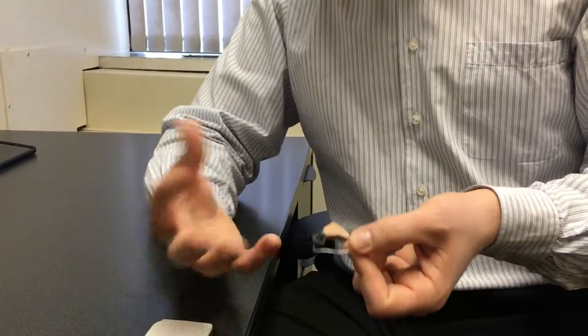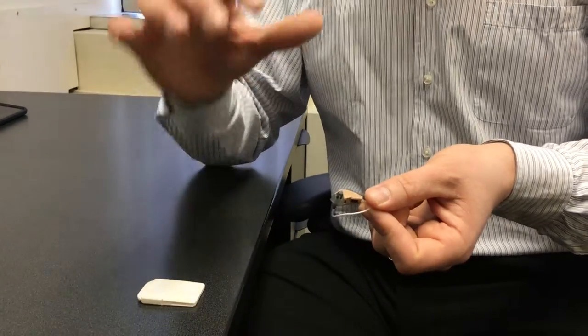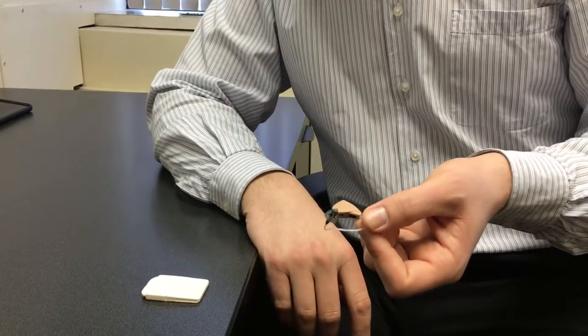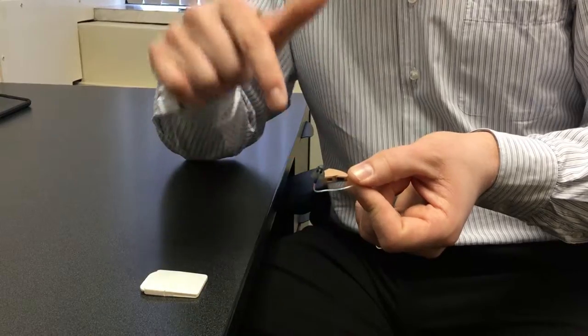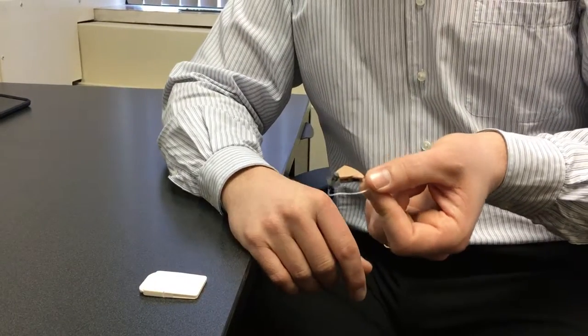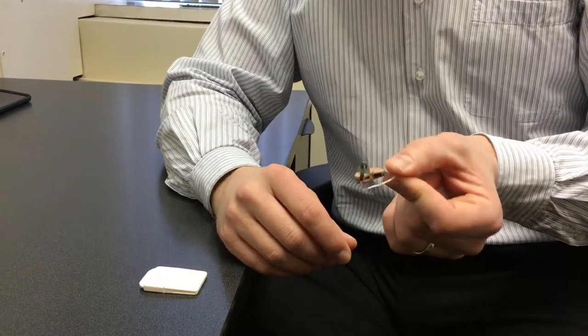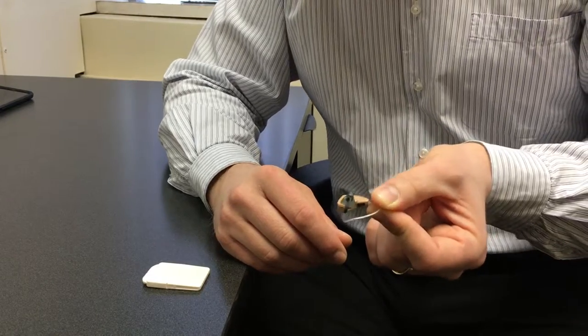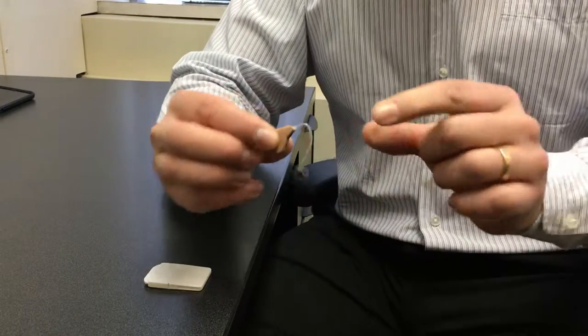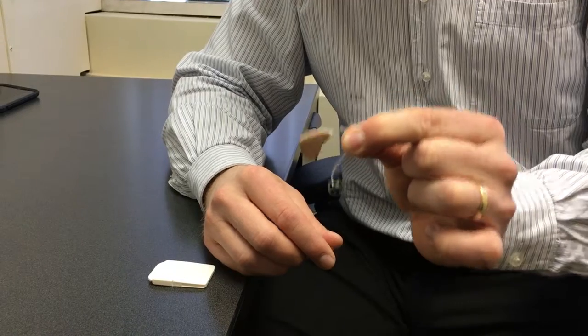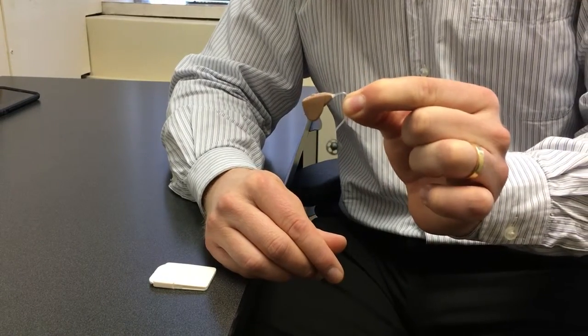So most hearing aids have some kind of wax filter in place and that just prevents the wax from getting into the working parts of the hearing aid. I'm just going to show you one type right now, this is a very common type of wax guard called a Serostop wax guard, and this is a receiver in the ear hearing aid which is also a very common popular choice.